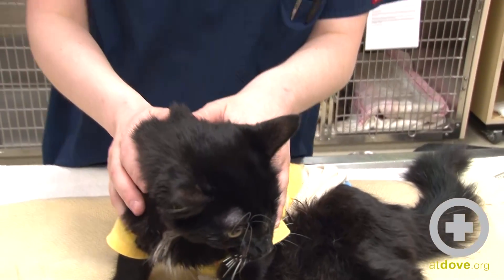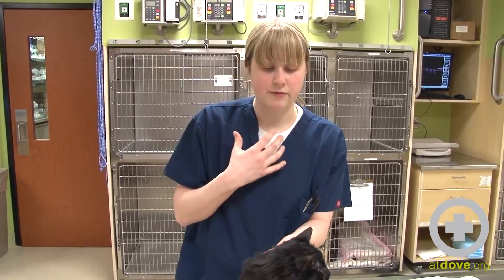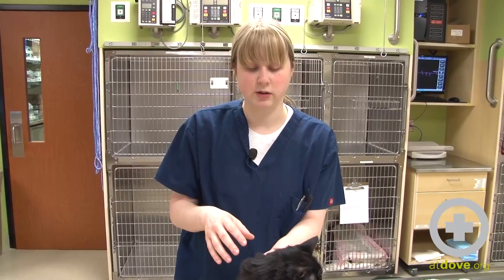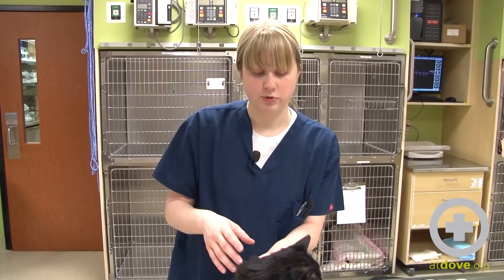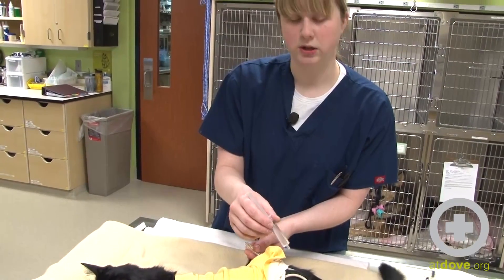The reason this cat had the tube placed was because she had cervical trauma, so there's a great deal of swelling around her esophagus. She did have a tracheal tear, so she didn't want to eat, and we don't want to do any more trauma to the site that's already there, which is why we did not place an esophagostomy tube. This tube holds about five to six milliliters.